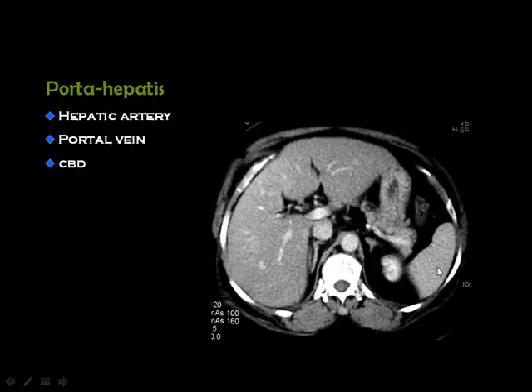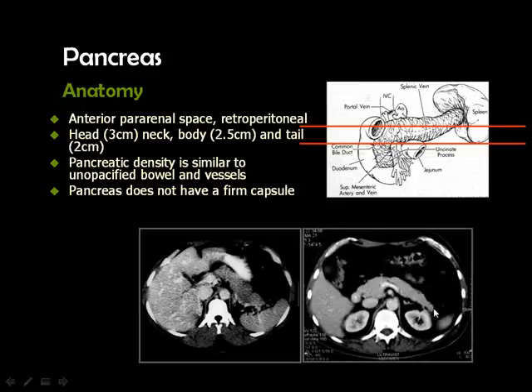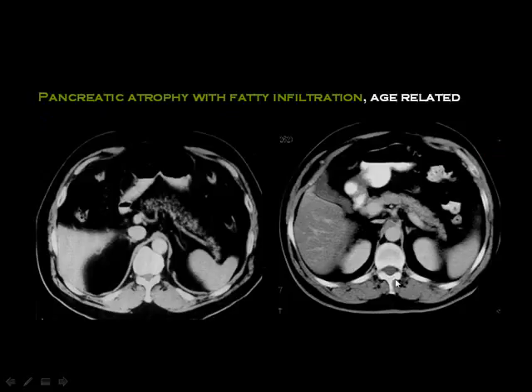A fatty liver appears slightly darker than the spleen on CT. The aorta, IVC, and diaphragmatic crura on both sides are identifiable. The pancreas lies obliquely in the abdomen, so scanning from top to bottom you first encounter the pancreatic body, then the head. In some people, the pancreas lies horizontally and the entire pancreatic tail, body, and head can be seen in the same section. The splenic vein lies posterior to the pancreatic body.